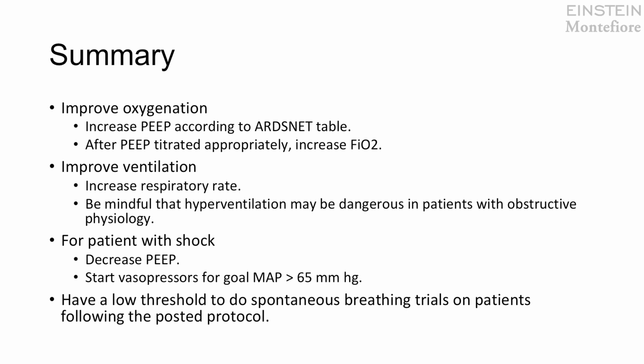For patients with shock, if they have acute hypotension, you can attempt to decrease the PEEP, which might improve their blood pressure, but also have a low threshold if a patient is truly sick for starting vasopressors, which can be done peripherally as a temporizing measure. But, of course, obtaining immediate help would be advised.